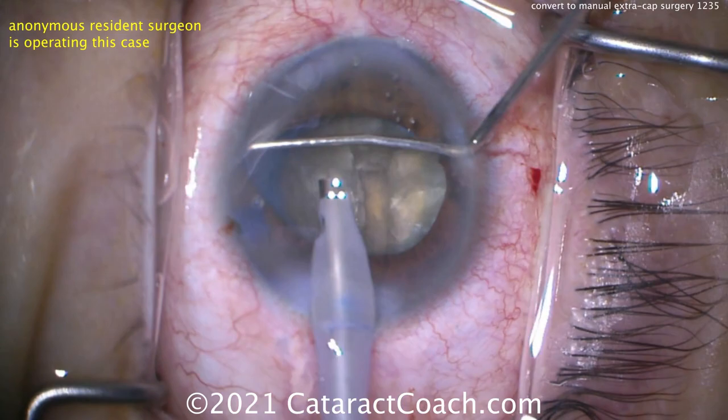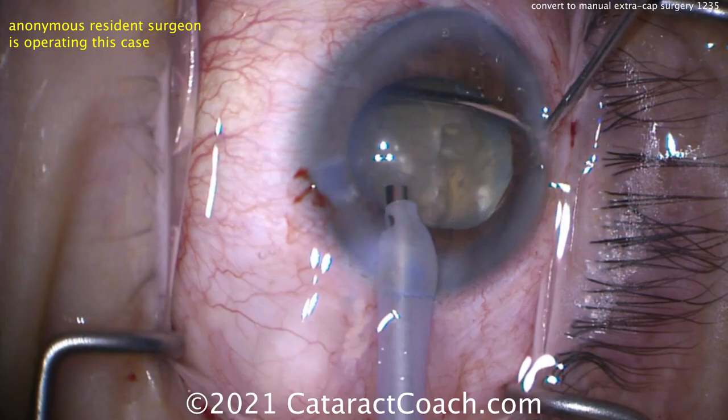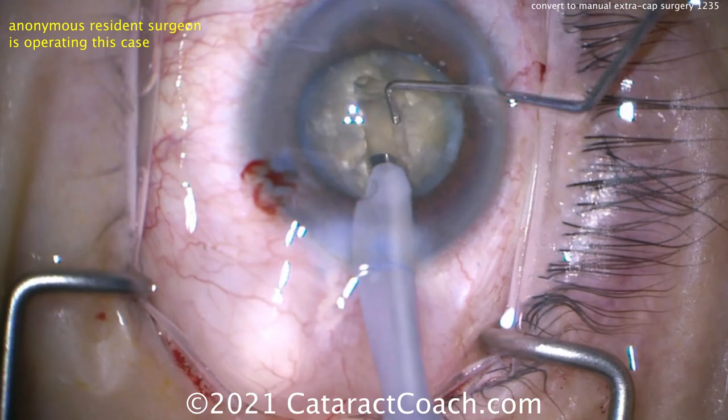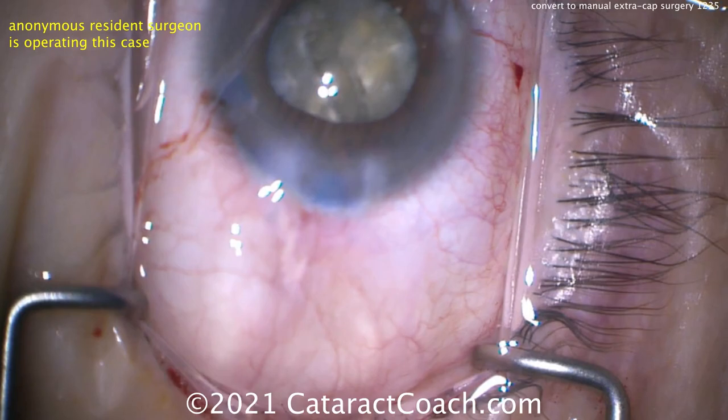What does that tell you? The posterior capsule is ruptured — it's open. We don't know exactly where it happened, but no question that lens capsule is open. You could try to split the nucleus, but the better part of judgment, seeing how mobile that nucleus is, is to just get it out of the eye. Let's not let it fall back. Putting dispersive viscoelastic to help support that nucleus.